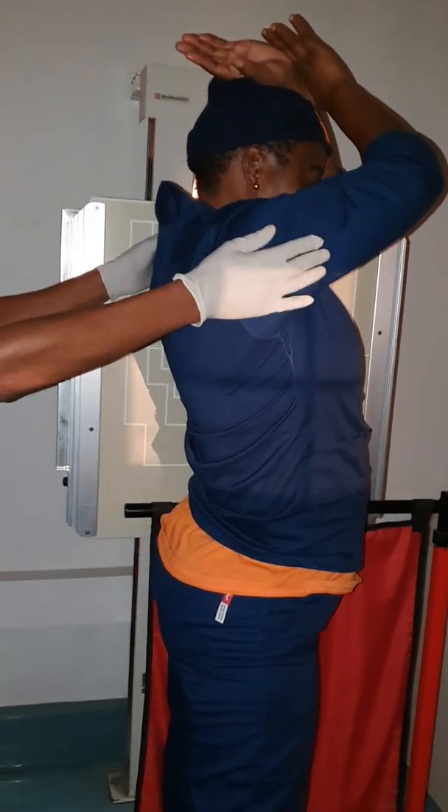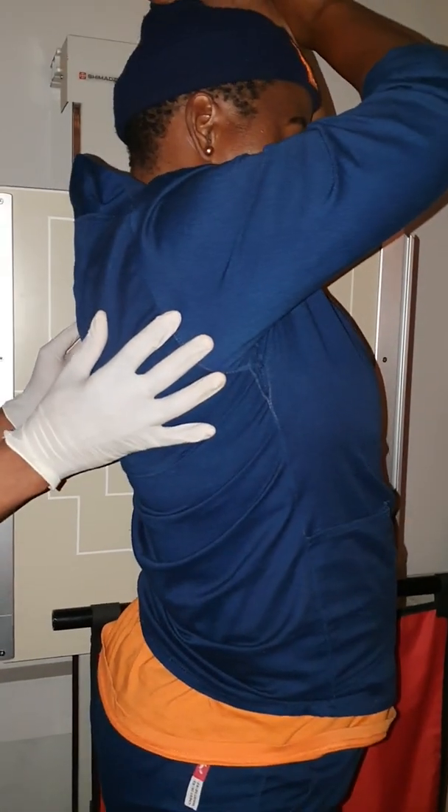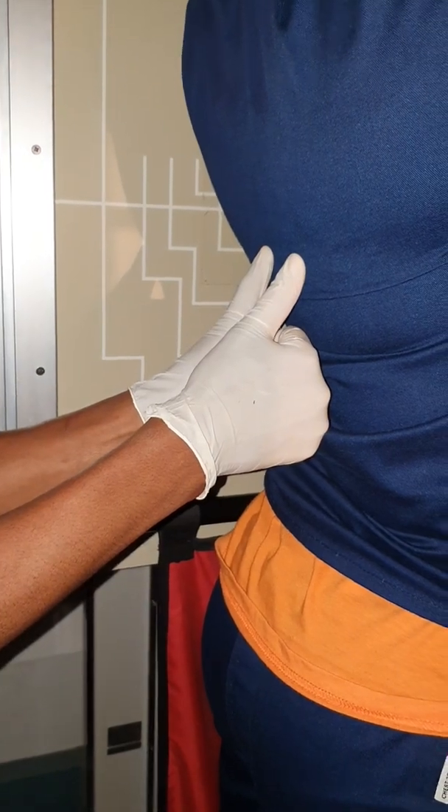Now you will test for rotation. Your posterior ribs need to be superimposed. You will use both thumbs — place both hands against the patient's back with your thumbs sticking out. You will pull your hands towards you, looking at the shadow to ensure both thumbs are superimposed.